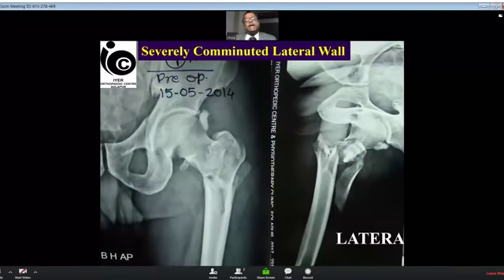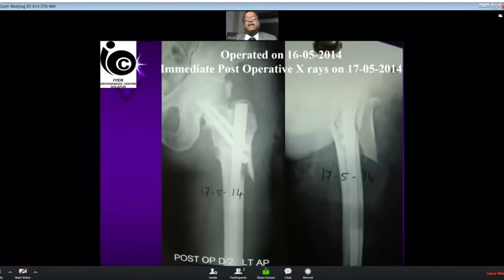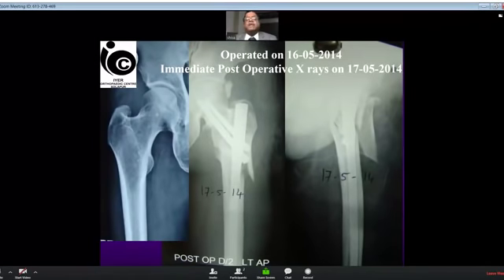Another case, a badly comminuted trochanteric fracture with a subtrochanteric extension. Again, you can see both the screw sets are touching the nail, and you can see the valgus is too much. The reason is that the person was young and there was a severe valgus on the opposite side also.